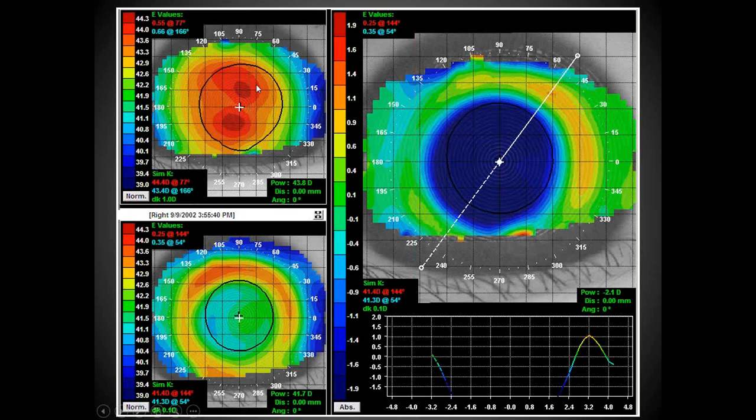Now this is the orthokeratology effect. You've got your astigmatic eye with your high eccentricity, your high rate of flattening, steepest in the center, flattest toward the periphery. Then by comparison, post-ortho-K, you see how you've sphericalized the pupillary zone, and that's what orthokeratology does. It takes a high aspheric cornea and turns it into a sphere.